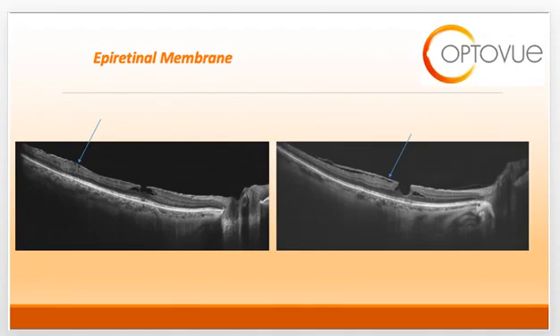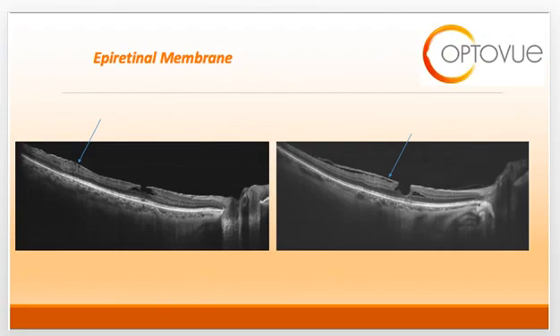Another entity in the topic of vitreo-retinal interface disorders is the formation of an epiretinal membrane. An epiretinal membrane is a thin hyperreflective sheet that overlies the internal limiting membrane. It can result from uveitis, retinal tears, or retinal detachments. In the setting of a posterior vitreous detachment, it usually has something to do with residual pieces of the posterior hyaloid that form a scaffolding or proliferation of cellular material on the surface of the macula. These OCT scans show that hyperreflective thin boundary at the anterior surface, which the blue arrows are pointing at.